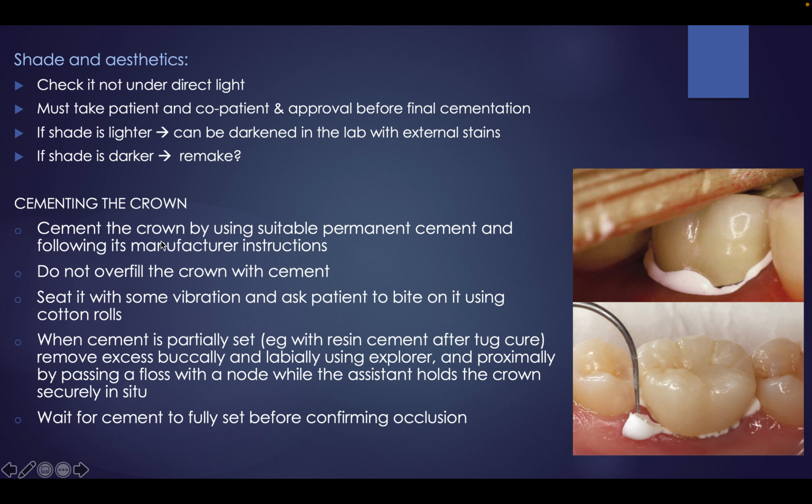Cementing the crown, you will be taking with Dr. Rohit. He will talk more in detail about it. You just have to make sure that you follow the instructions of the manufacturer, that you have placed the right amount of cement, and that you have removed all the excess cement before you dismiss the patient.